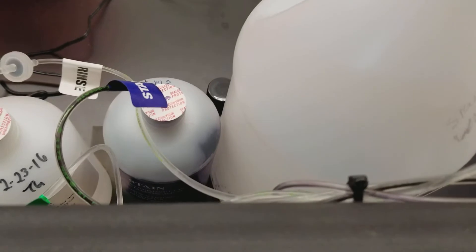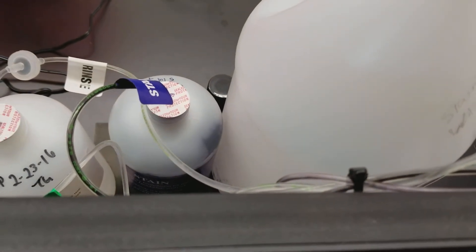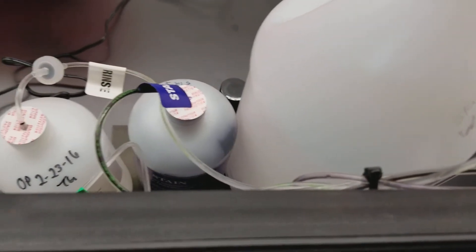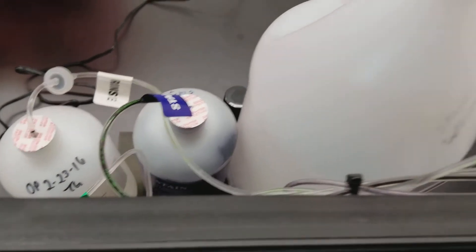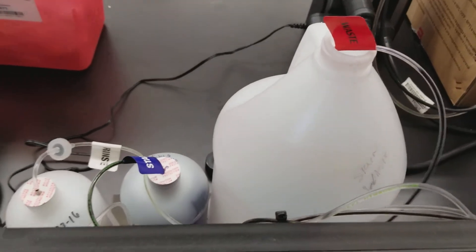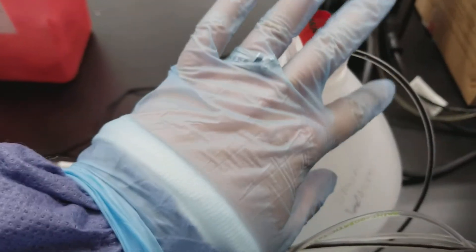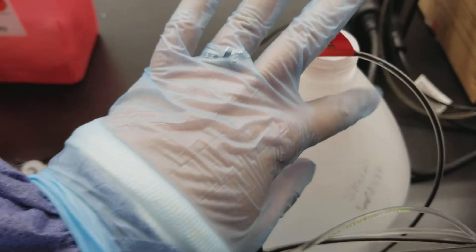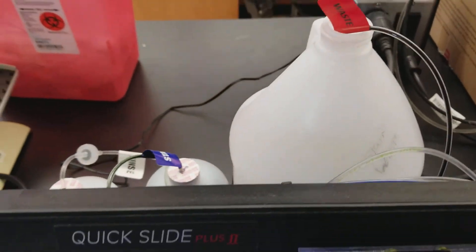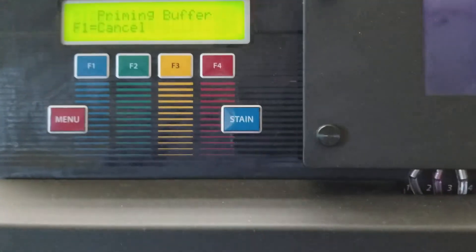So right now it's priming the stain line. See it moving? That purple. The rinse is on the left and the waste is on the right. Everything that goes in comes out and ends up going in the liquid waste and that is not something you're going to dump down the sink.